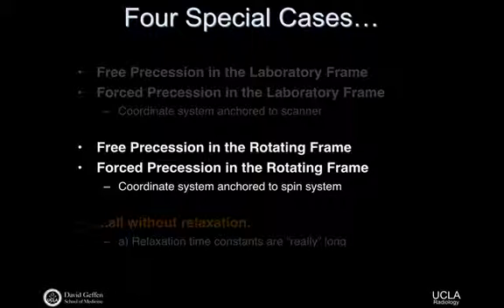This term here, if the understanding is that we're just exposing the system to the B0 field, that's what governs the difference between the laboratory and the rotating frame, can be equivalently the gamma B0 along the K hat prime direction divided by gamma.